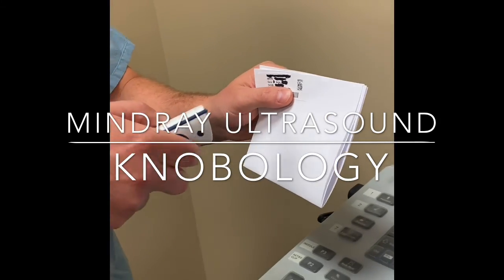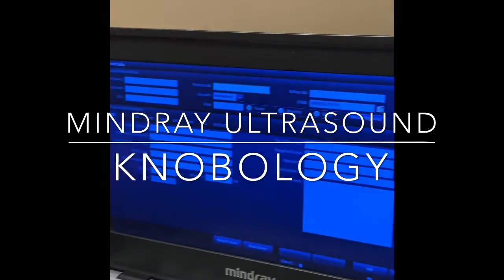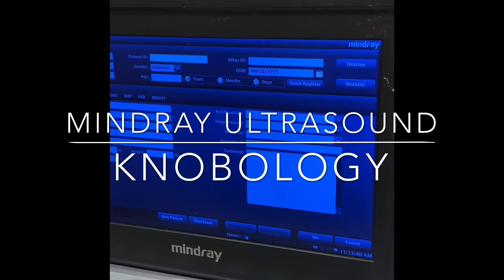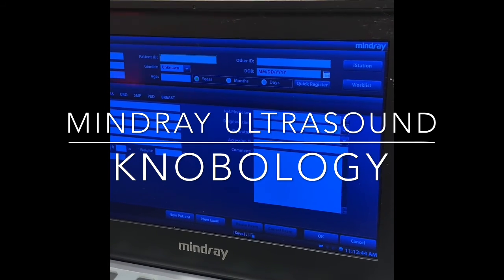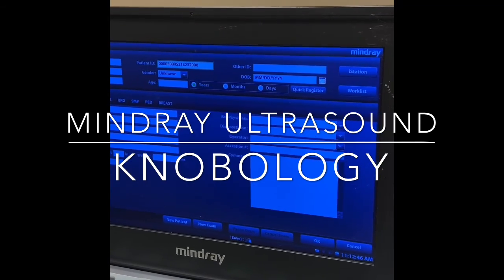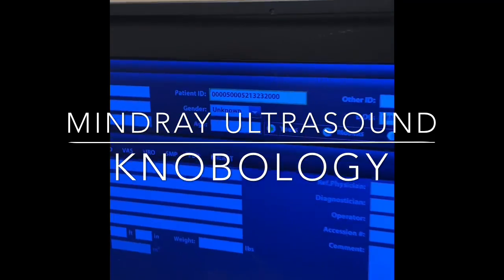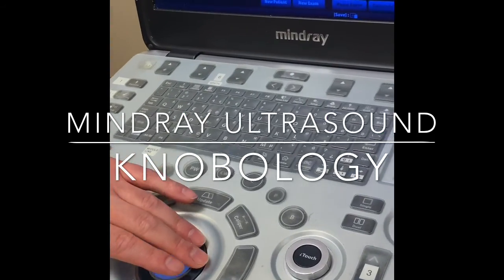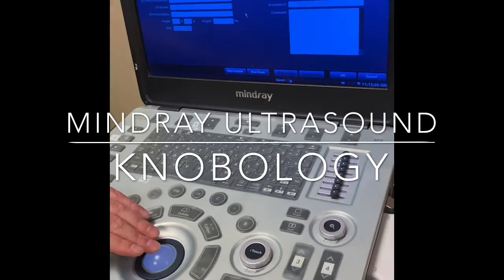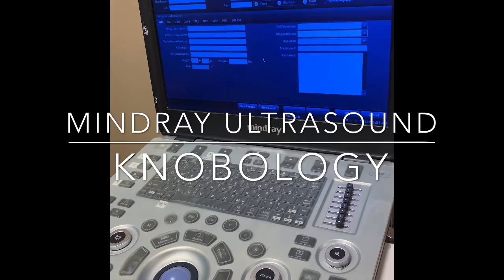What you'll see me do now is scan the patient MRN, and you could look at the screen to see what happens. So you see that the number popped up here in the patient ID field. Note, you do not have to select this field for this to happen. No matter where the cursor is on the screen, it will automatically go into that field when using the Mindray.